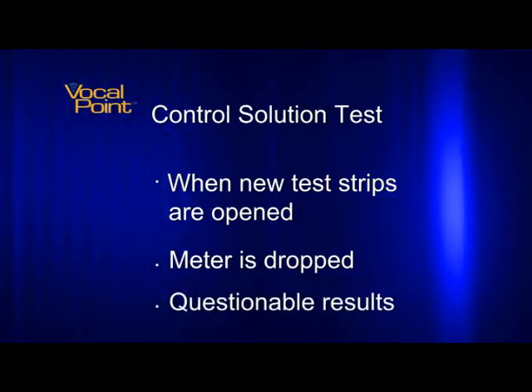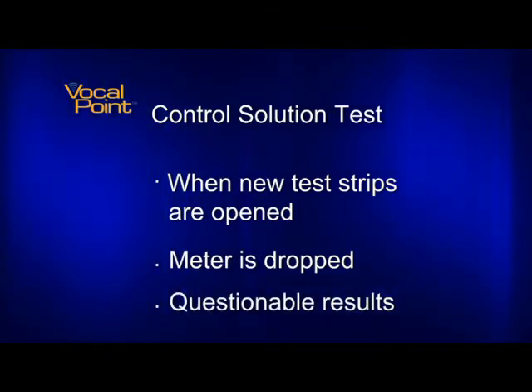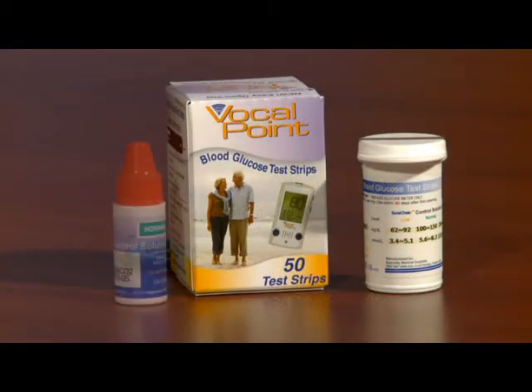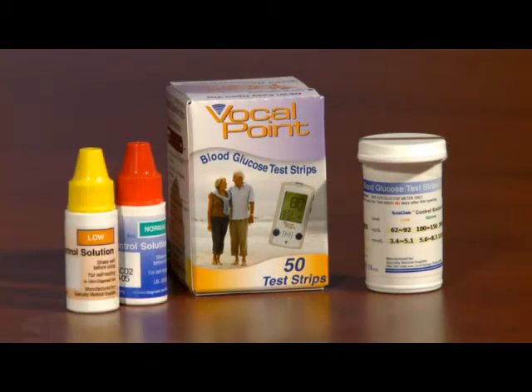If the meter provides questionable results, you should also run a control test. The supplies required to run a control test are test strips, a vial of control solution, and tissues.